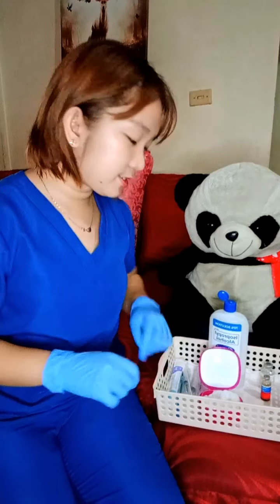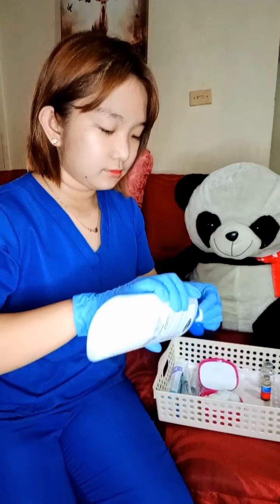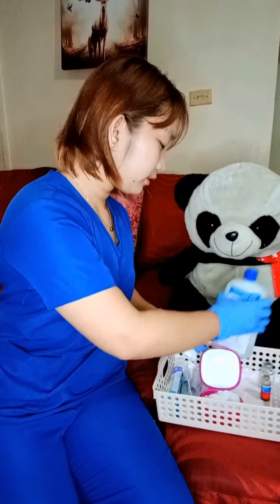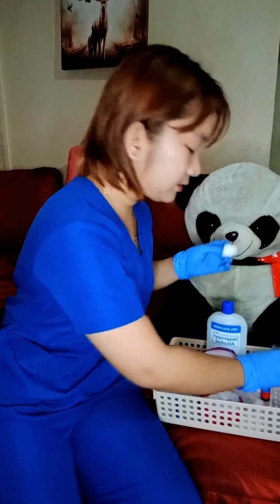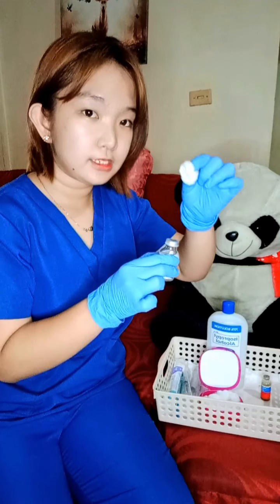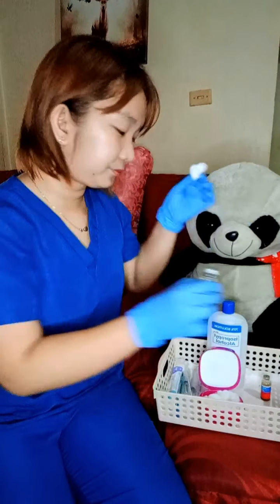First, get a clean cotton swab and put some alcohol. Then get the medication ampule by the neck and make a circling swipe on it, like that.